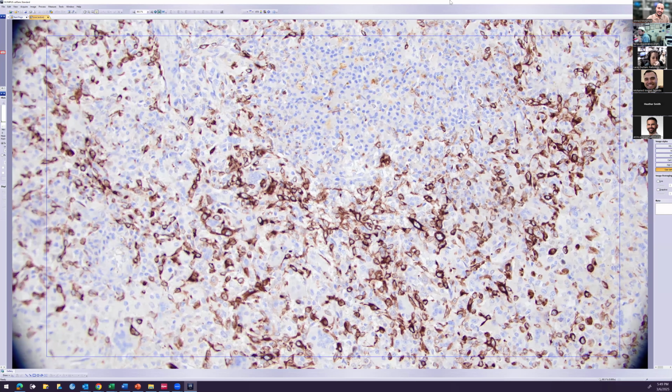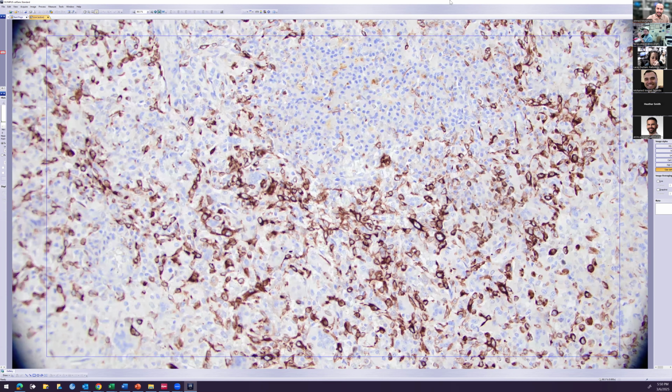The background, not particularly, right? But when you think about it, it's missing, either for the classic type or distal type, the pseudogranulomatous geographic necrosis, right? If you're wondering whether this could be more like proximal type, that tends to be more sheets of epithelial cells, but you don't really see giant cells, right? So you might wonder about that though. Why are there so many keratin-positive cells in here?